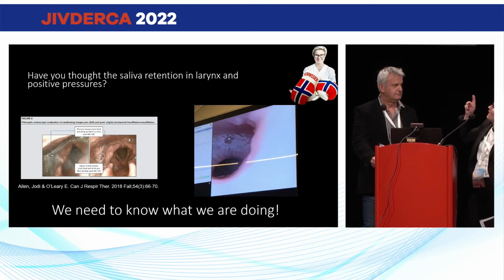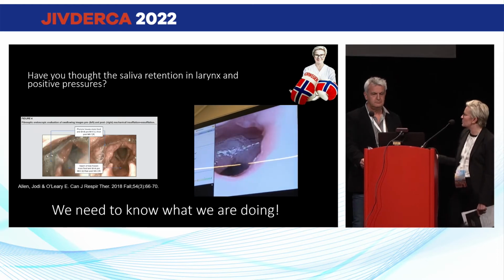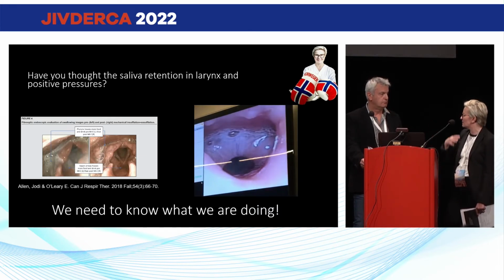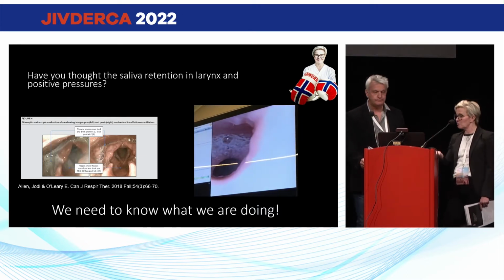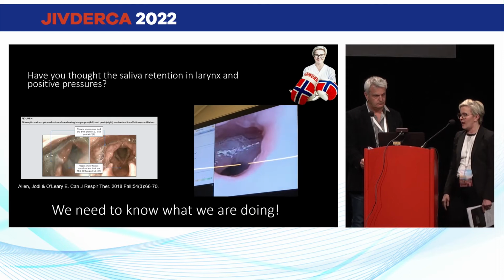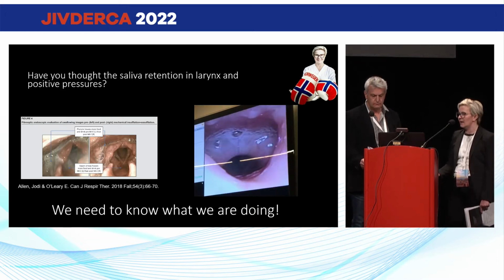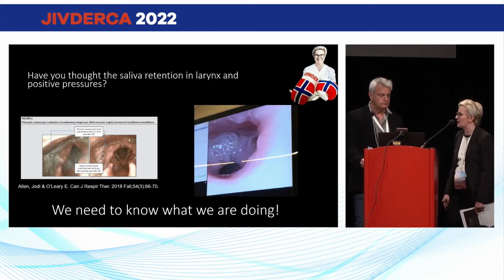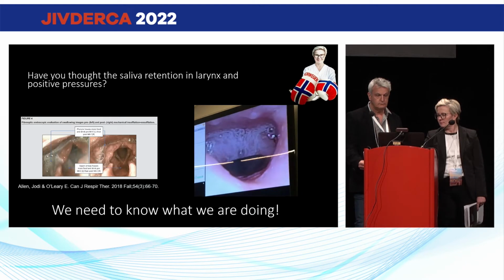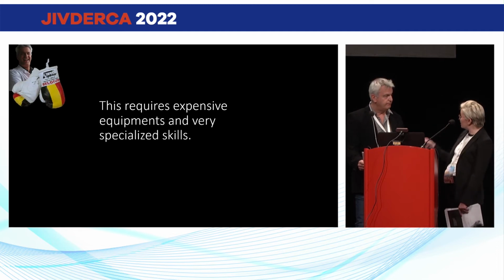Have you thought about saliva retention in the larynx? Do your patients have any saliva problems in their larynx? When you apply positive pressures, we might blow the saliva into the lungs. Here's one case report from the UK that showed that saliva retention in combination with MIE use could cause aspiration pneumonias. And this is what we see when we visualize the upper airways, that we are blowing the saliva down to the lungs.